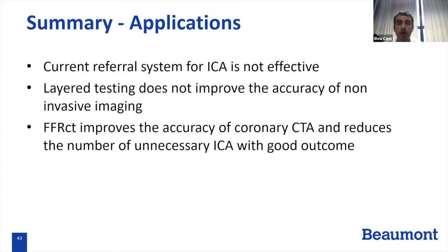And he compared arteries that had calcium with arteries that did not have calcium, and how the accuracy compared on FFRct. It was a little bit lower, but the difference is very small. We're talking about like 88% accuracy versus 85%. I'm just making those numbers up. There was like a 3% difference. So it's minor, and there's still a lot of value in this.